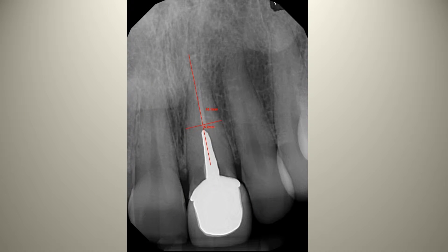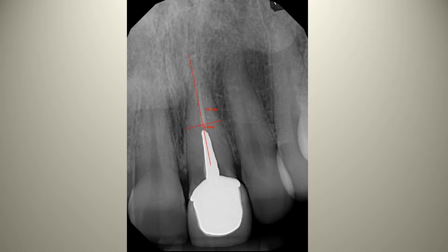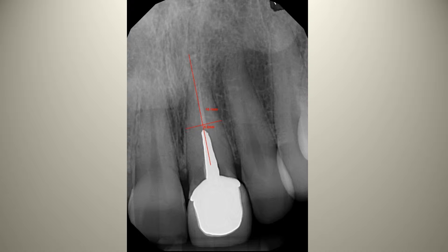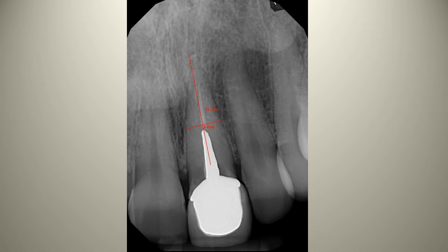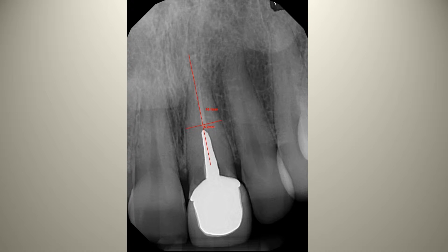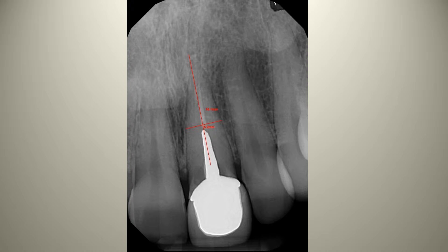In this radiograph, using our implant treatment planning software, we determined that we have about five millimeters of width and around 16.1 millimeters of height. One can also appreciate a bit of radiolucency in the coronal aspect of the post, basically signifying where this restoration had failed. In this particular case, we're going to place a MIS-7 5.0 by 13 millimeter implant, and in the video we're going to demonstrate what an atraumatic extraction should look like.